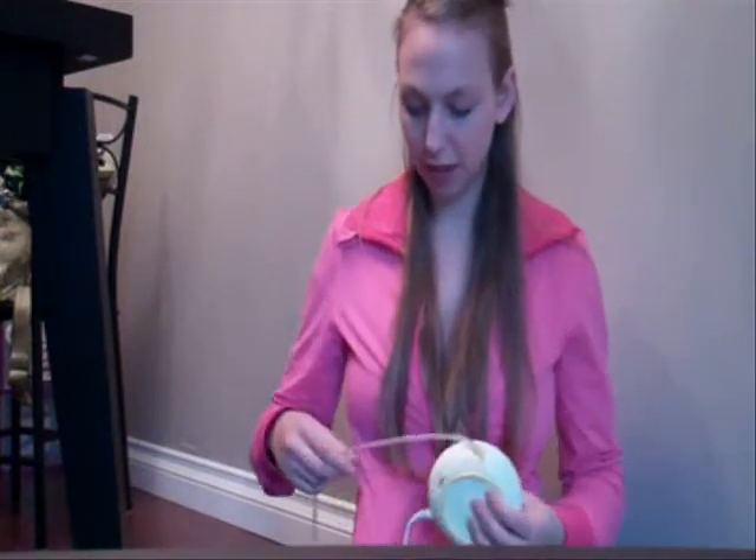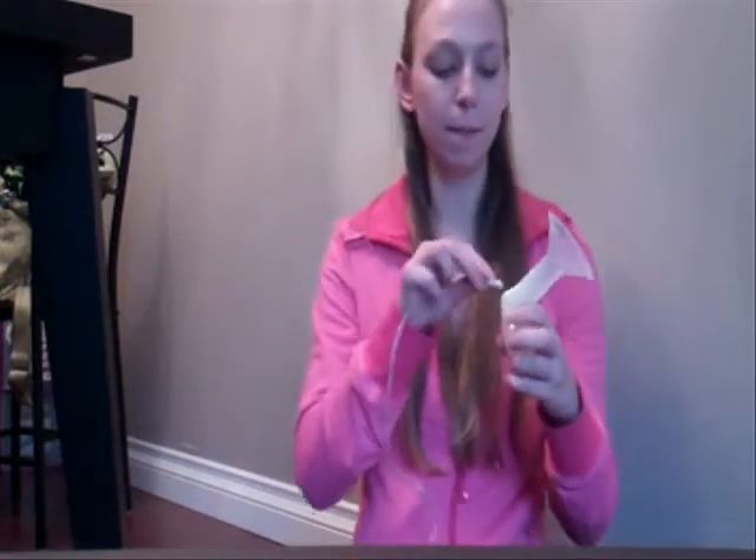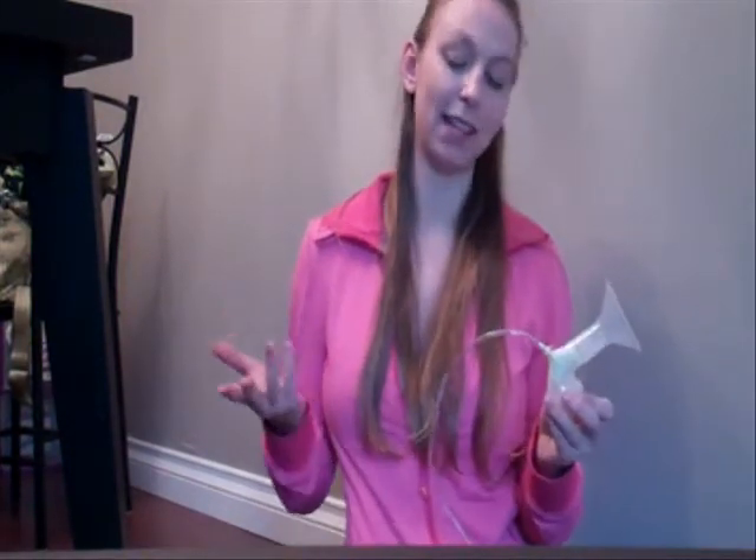Another thing is this piece that plugs in here — it's not very secure, it's not in there very well. So I've got to be really careful not to let that slip out, because it's happened quite a few times. You've really got to hold it and almost have your hand right there. But I can live with it — it's not that big of a deal.